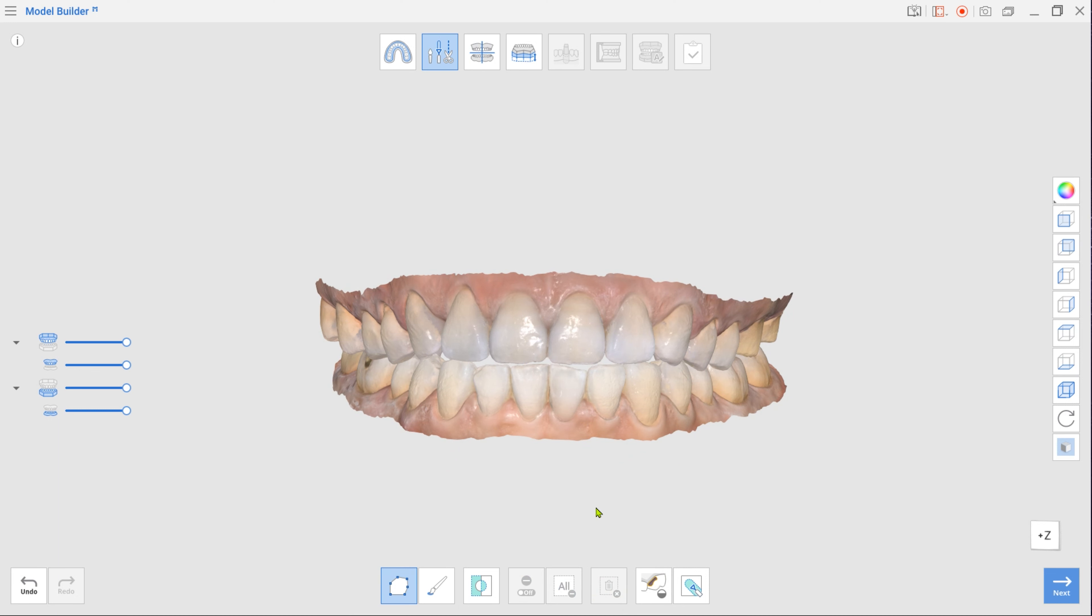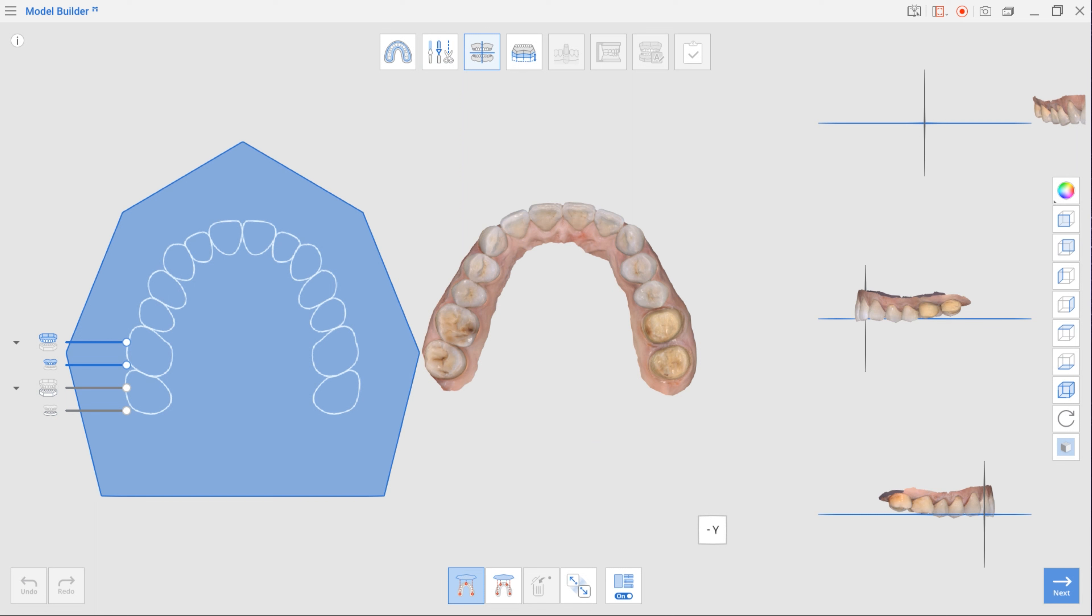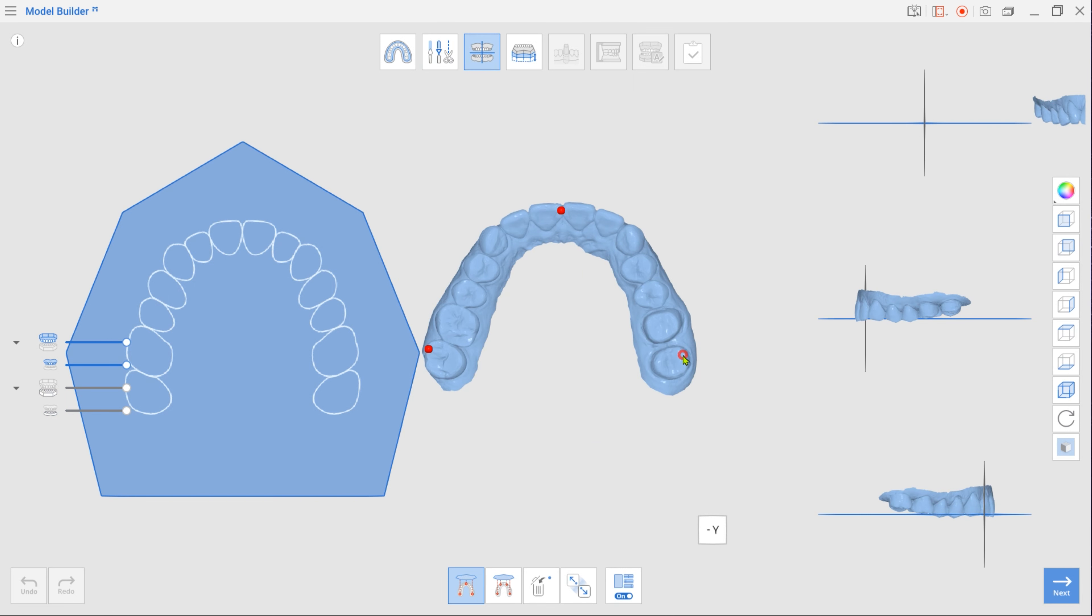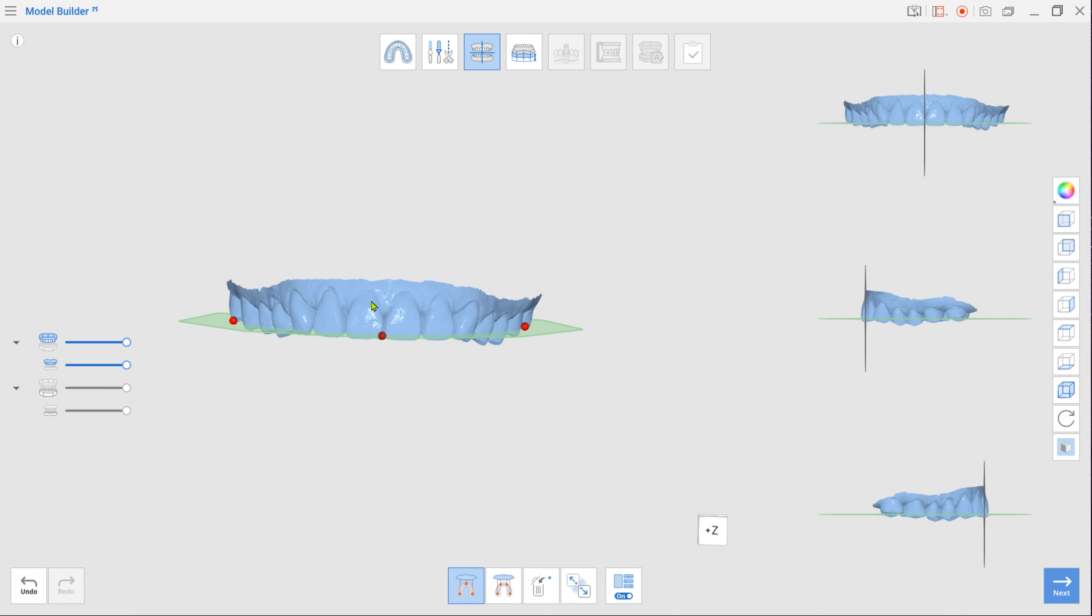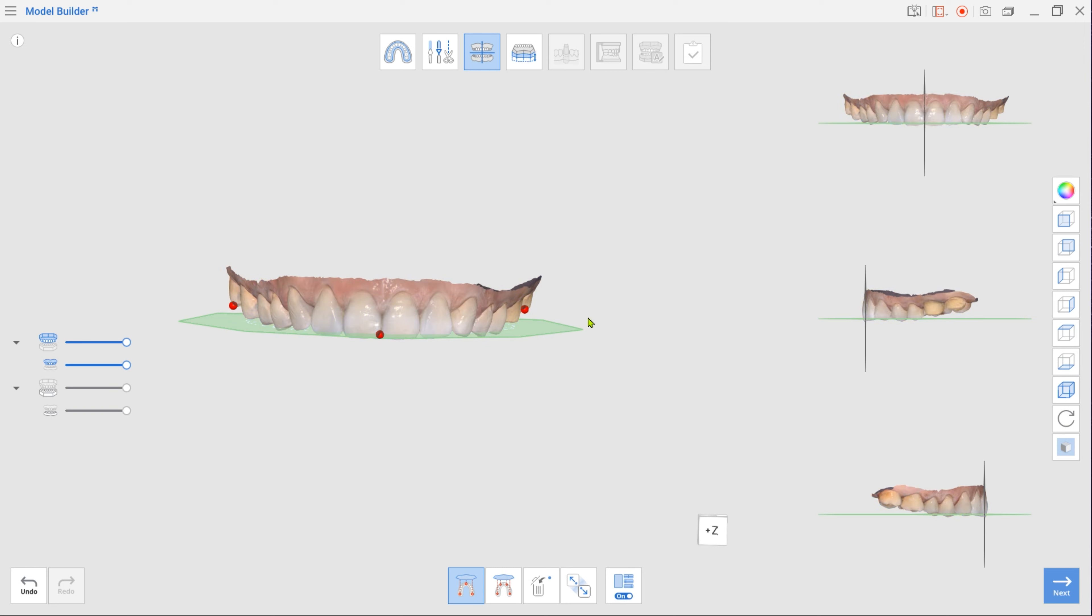Once done, move to Alignment mode. Select three points on the data as shown in the video to align it with the virtual occlusal plane. Ensure the data is properly positioned by reviewing it from all angles in multi-view.